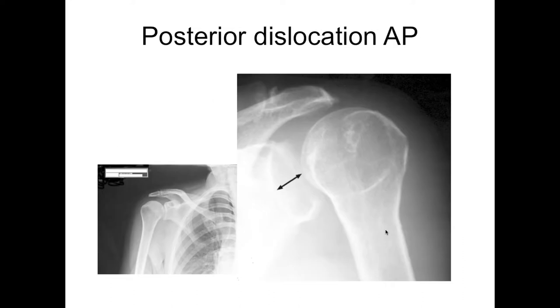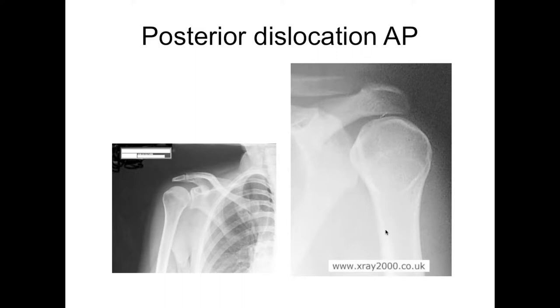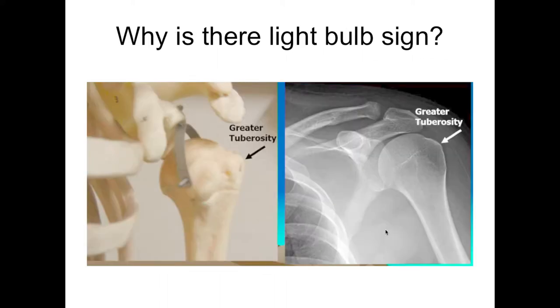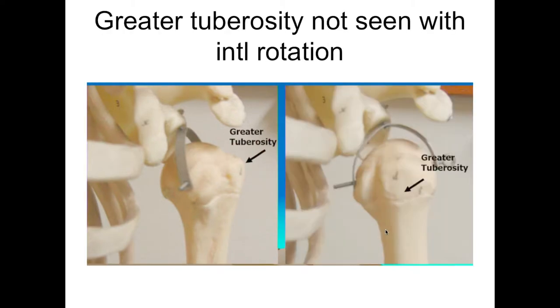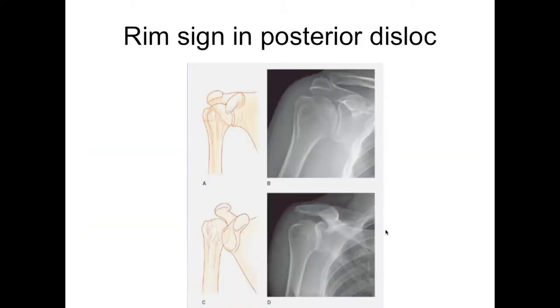They hold their arm in internal rotation and can't externally rotate it. There's the light bulb sign — it's internally rotated, so you don't see the greater tuberosity. Here's normal: it's got this rounder greater tuberosity shape. When it's internally rotated because it's posteriorly dislocated, the greater tuberosity is not seen. Here's normal, and now it's turned inward — you get this light bulb sign.